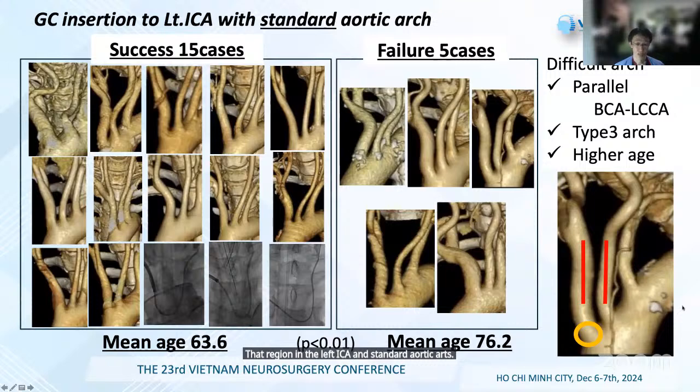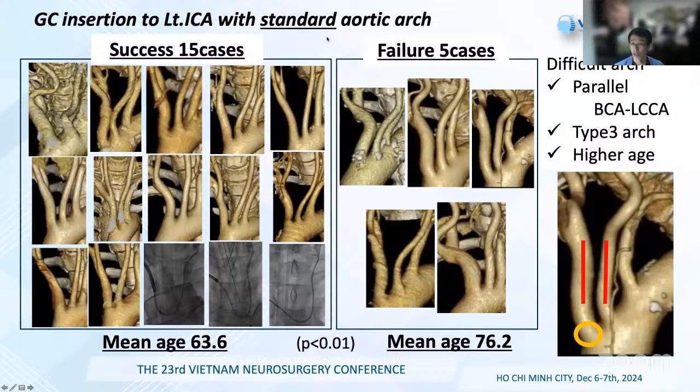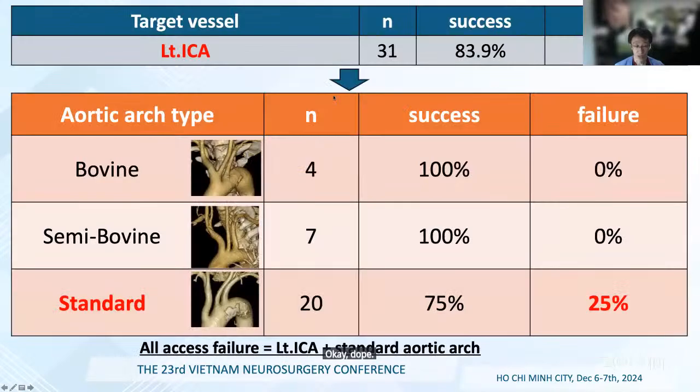So in these 20 cases, I took the picture of the aortic arch like this, and the success in these 20 cases, sorry.